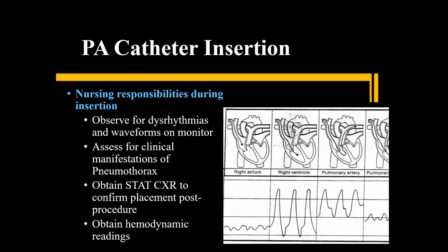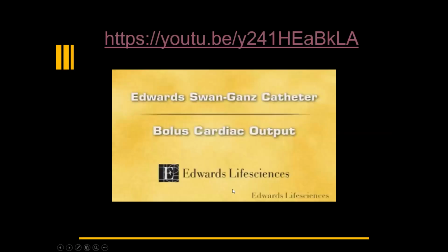kind of ventricular dysrhythmias. Cannot use until you have a stat chest x-ray, because remember I said one went up into the neck. And then we're going to get some hemodynamic readings once we've confirmed placement.